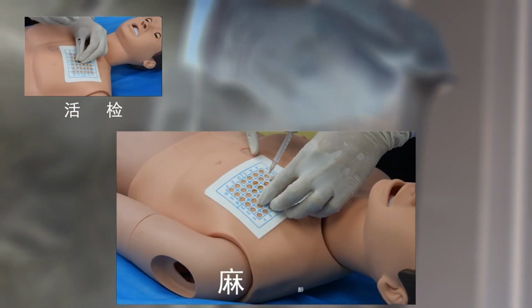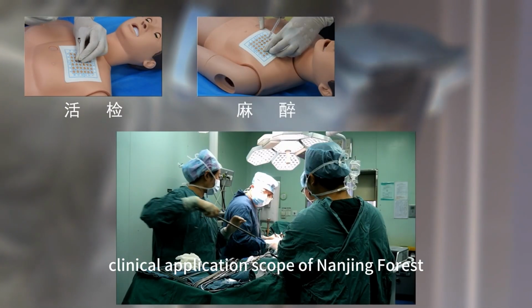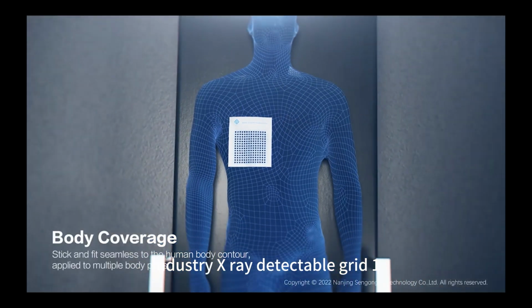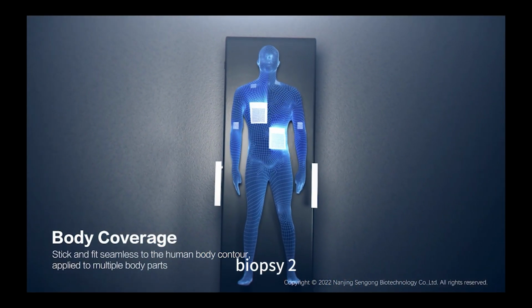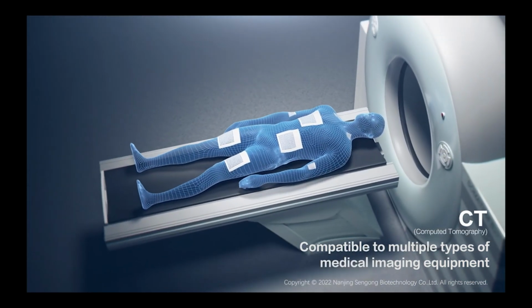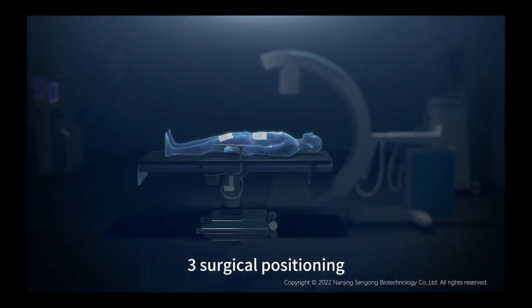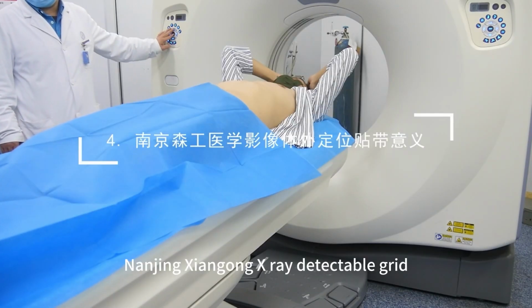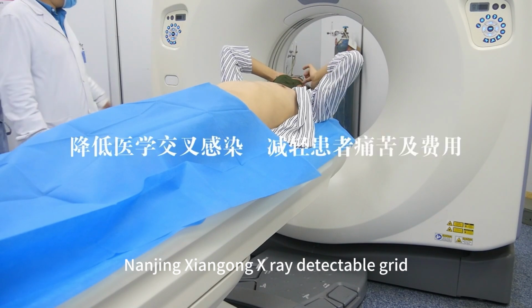3. Clinical application scope of the Nanjing Sengong X-ray detectable grid. 1. Biopsy. 2. Anesthesia. 3. Surgical positioning. 4. Nanjing Sengong X-ray detectable grid.